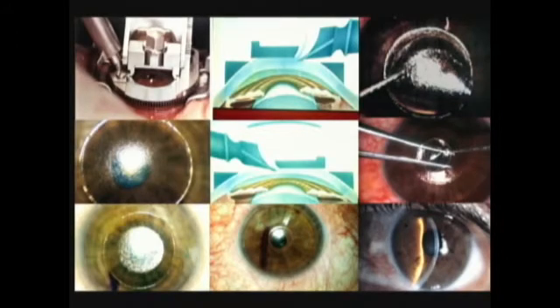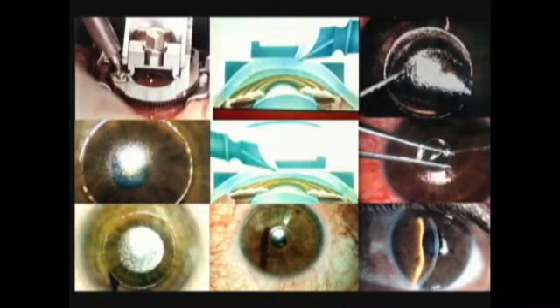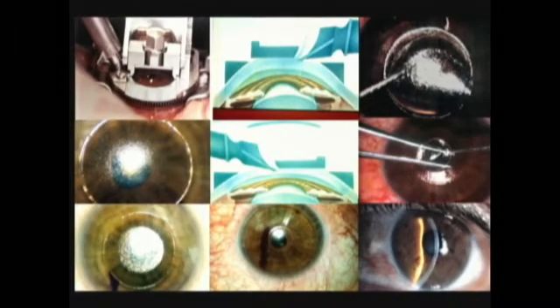And then, of course, we have to replace the flap back in the original position. At the beginning, we used interrupted sutures, then running sutures, and later we didn't use sutures at all. With compressed air, we fixed the disc back in the original position.